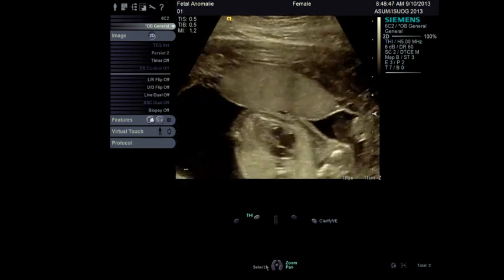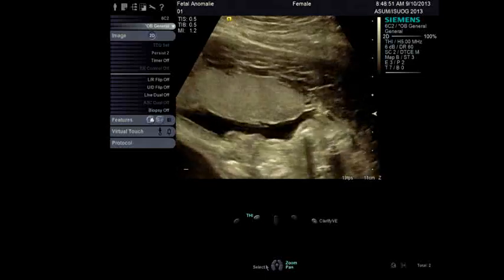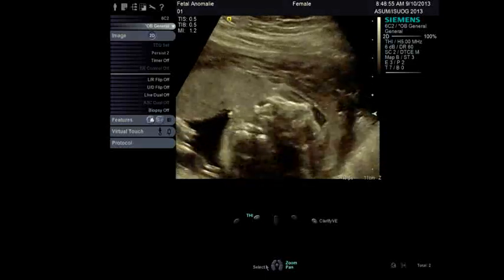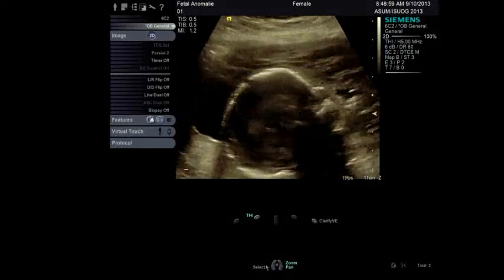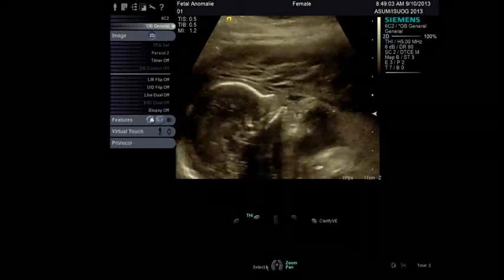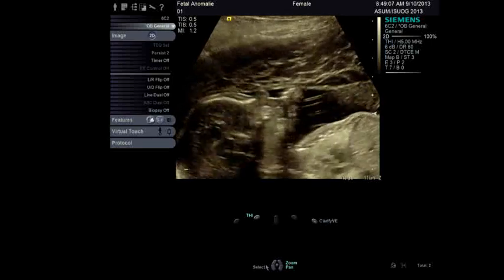My name's Aris. I'm a consultant in fetal medicine. I work in London and in Oxford. And we're behind the screen here with this nice lady who's volunteered today, and a very nice baby. In true tradition, or contrary to tradition, actually, this baby's behaving really well for our live scan today.